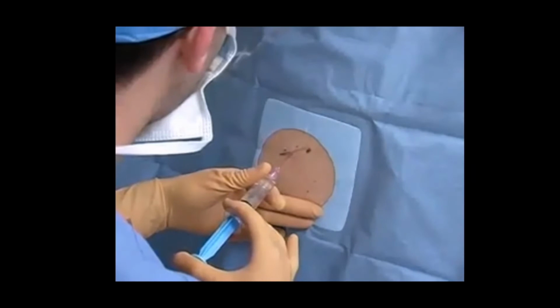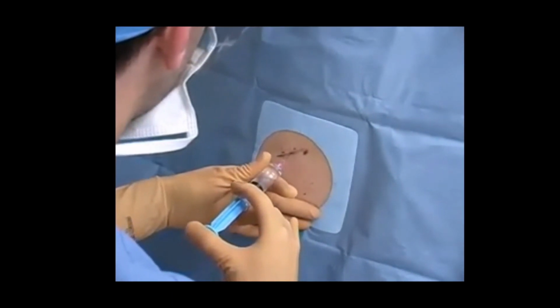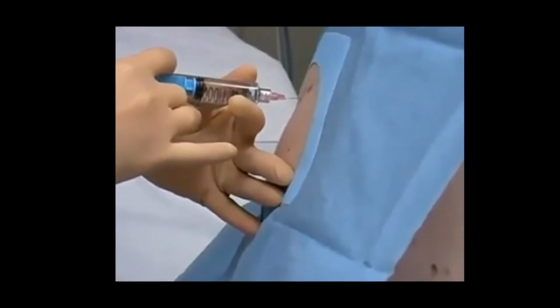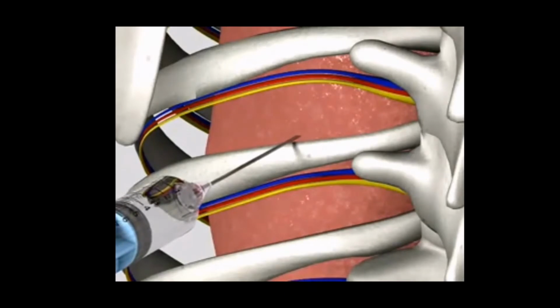Using a 25 gauge needle, place a wheel of anesthetic over the superior surface of the selected rib. Advance the needle through the wheel until it comes into contact with the rib, and then gently walk the needle over the superior surface of the rib. This technique avoids injury to the neurovascular bundle that runs along the inferior surface.